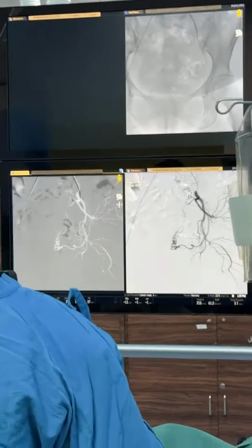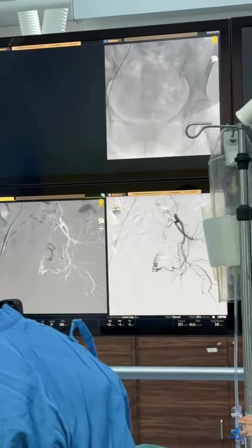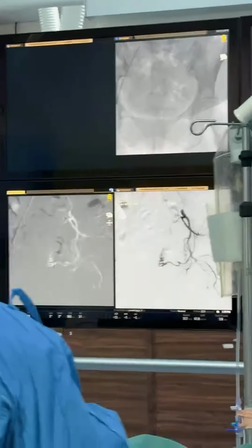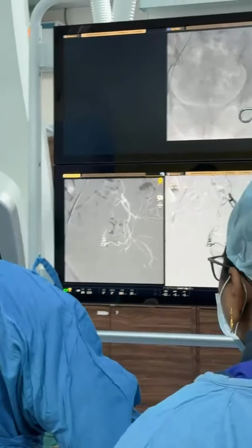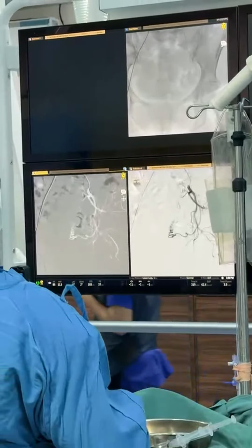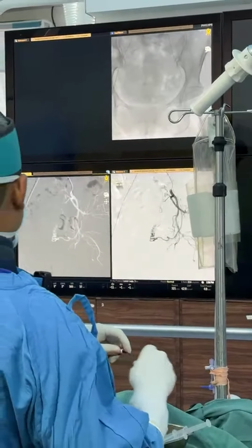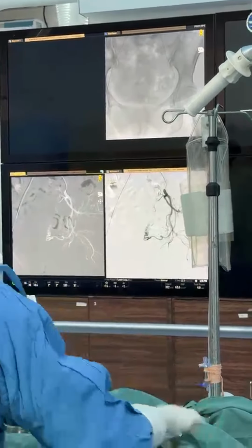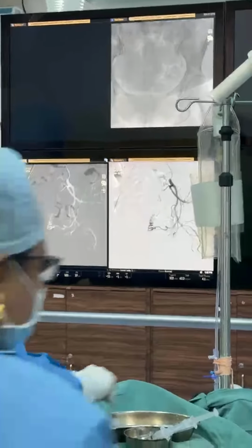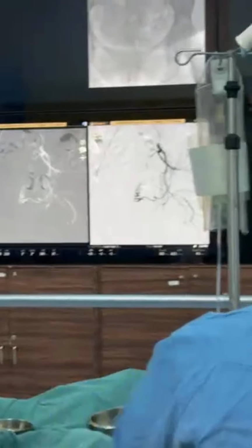Black cobra. Regular. We can take a prograde if required. Hold the seat. Why are you sitting there? You don't have a RUC?